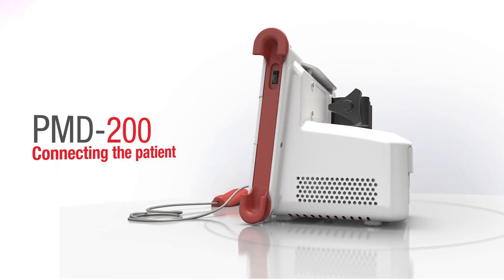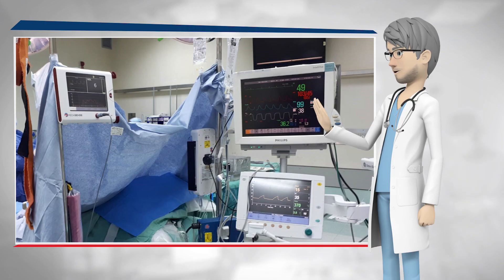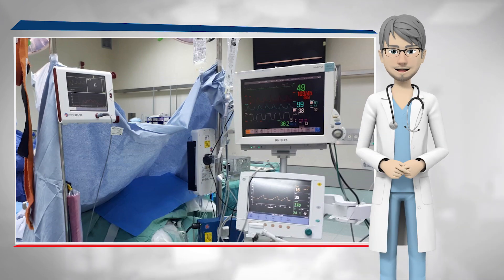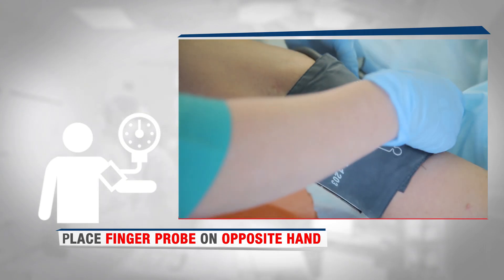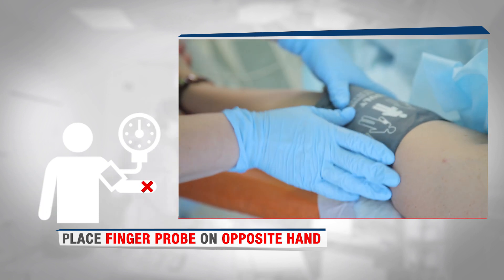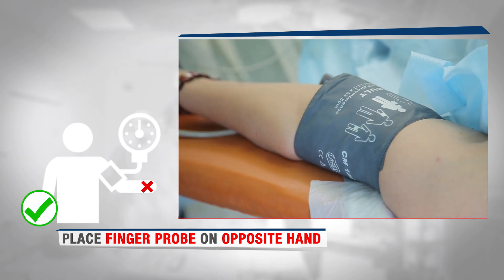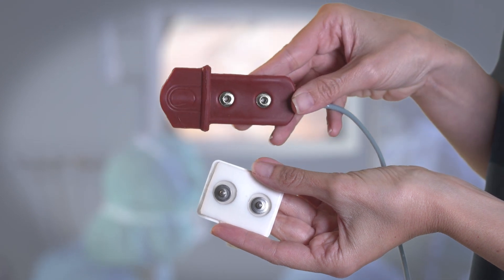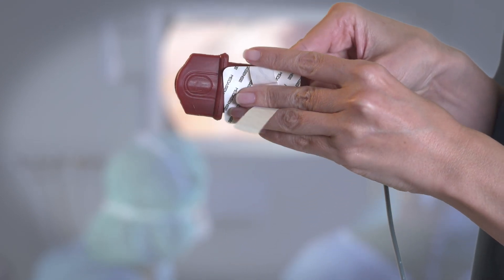Connecting the patient. Connect the patient to the PMD200 monitor together with all the other monitors and after finalizing the patient's positioning. If you use a blood pressure cuff, make certain to place the finger probe on the opposite hand to avoid artifacts. Connect the single-use sensor to the finger probe with the strap to the right side.